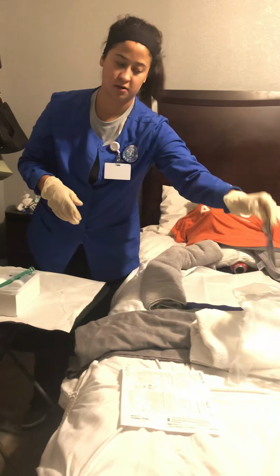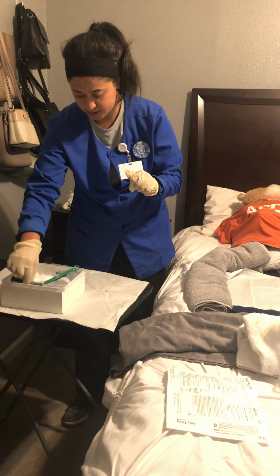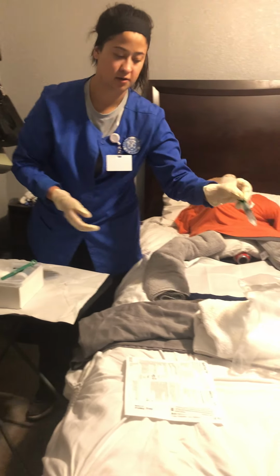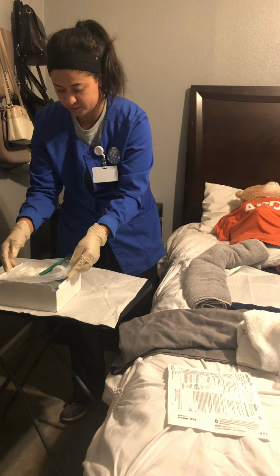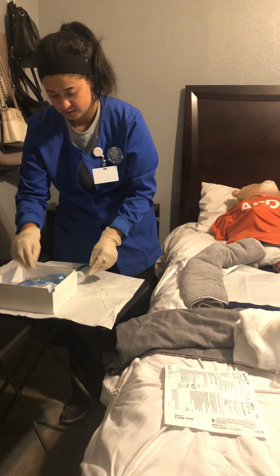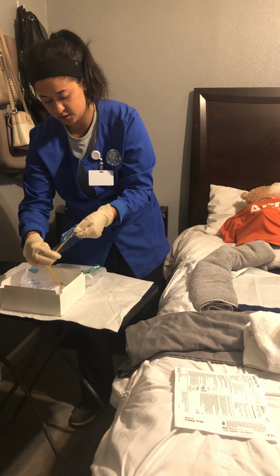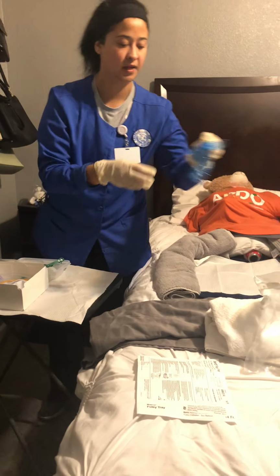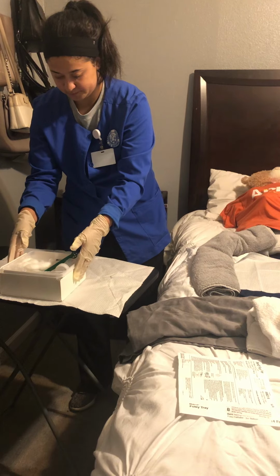Once I do that, discard of that. Then I'd get the lubricant and put it there, and then discard of that. I'm gonna place this, oh, I need to remove the sheath of the catheter. I wanna hold on to it just so it doesn't wiggle everywhere, and disregard of that. I'm gonna place this back on there.